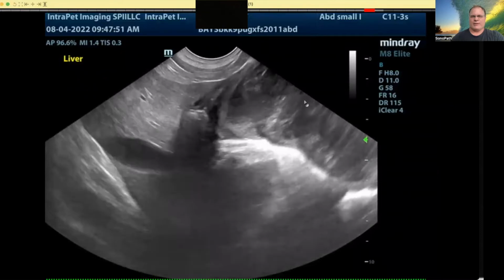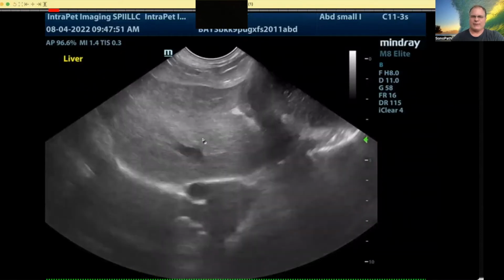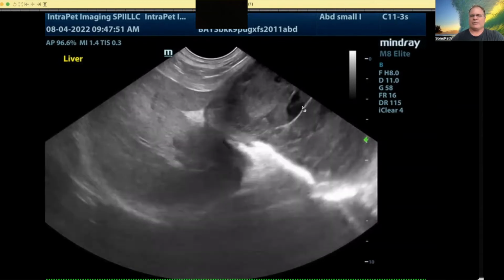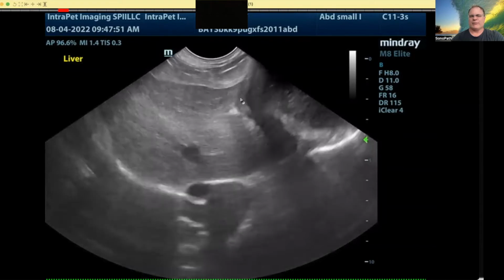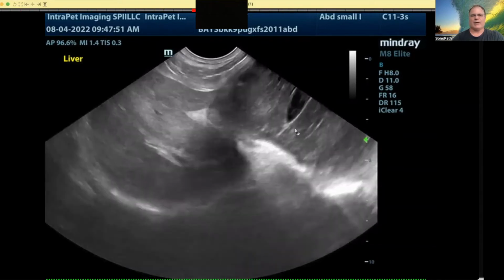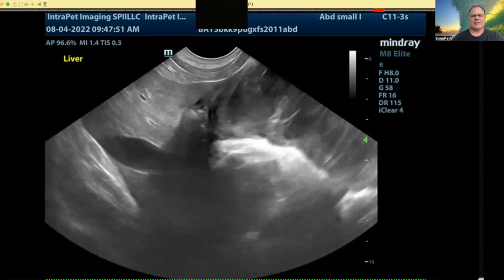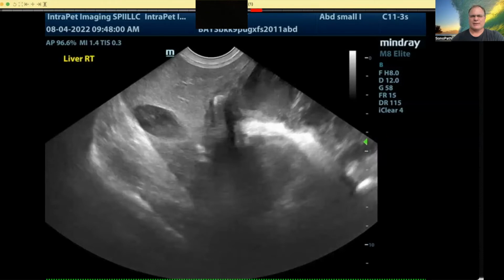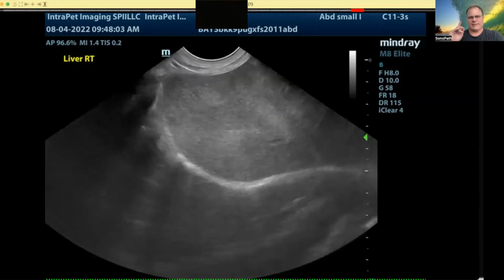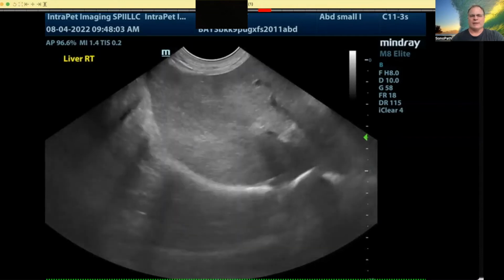So we see this big ugly thing here as it heads over to the pyloric outflow. How many of you are thinking this is gastric stasis, just metabolic ileus, or maybe the pylorus or duodenum are tied up by pancreatitis? Entirely possible. Well, that's when I first looked at it, I was like, that's probably it. But then I looked a little bit further and listened to my own conscience. Listen to that conscience in the back of your head, because it will really serve you in these tougher cases.